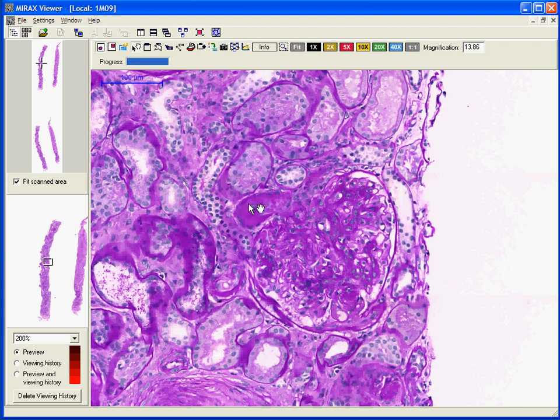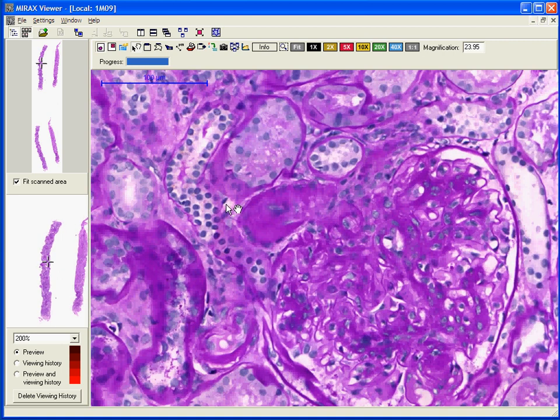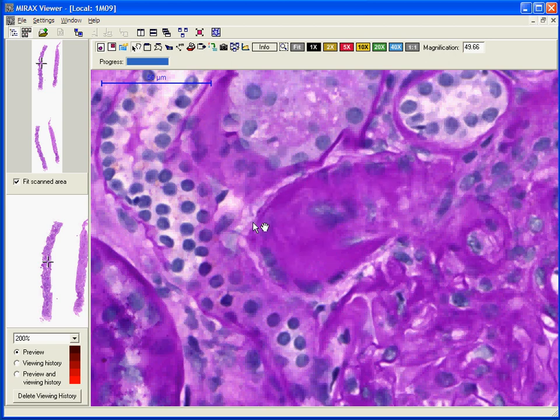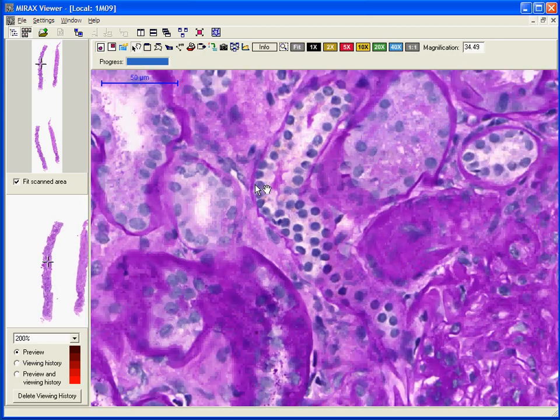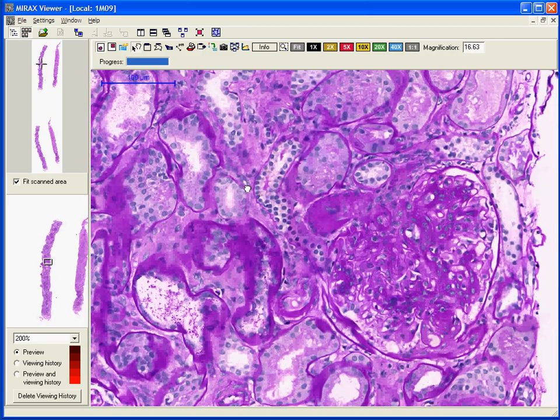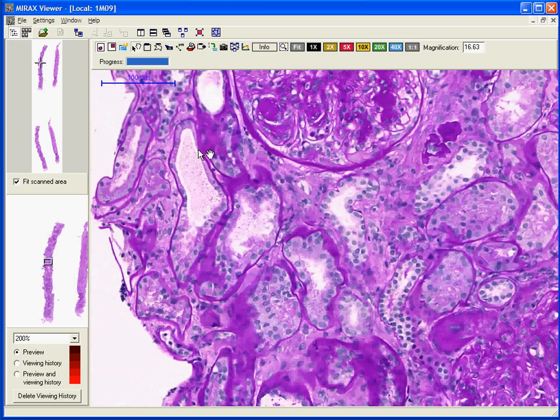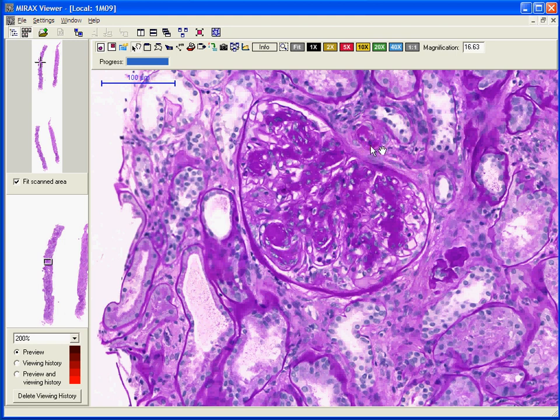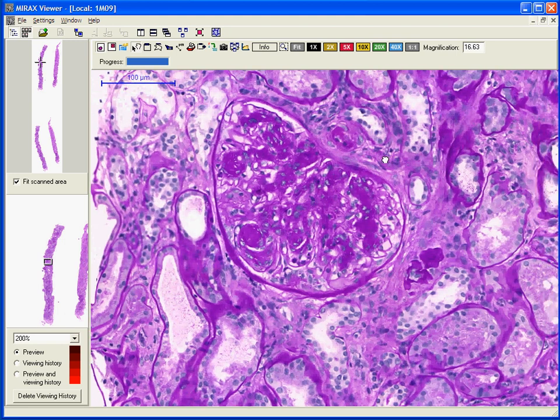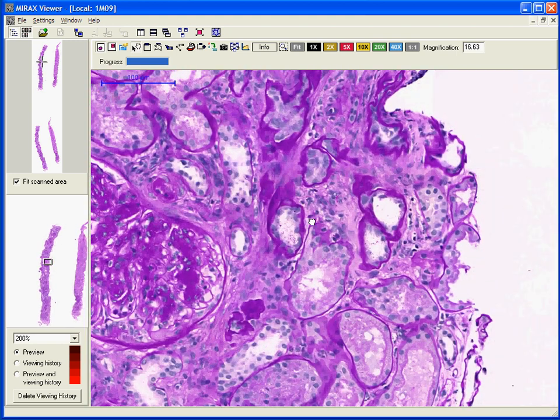Here, we observe hyaline deposition in the arteriole at the vascular pole of the glomerulus. Hyaline arteriosclerosis is a frequent manifestation of diabetic renal disease, and is also more pronounced in diabetes than in other diseases of the kidney. Here is another arteriole showing hyaline deposition.